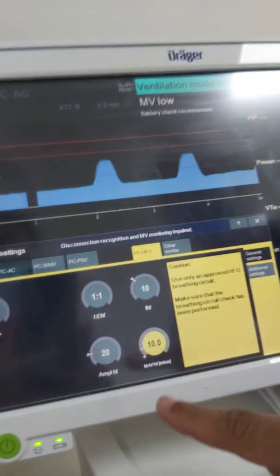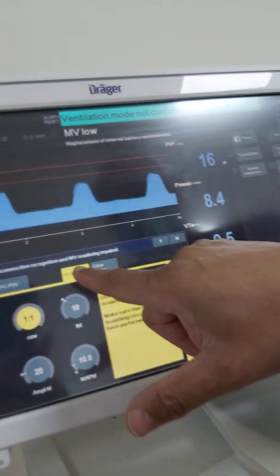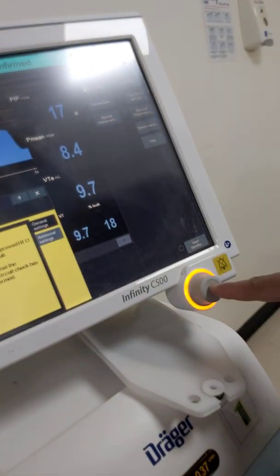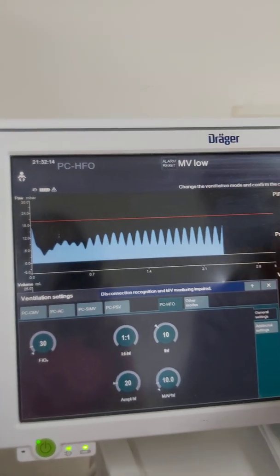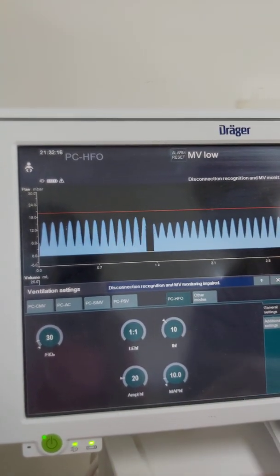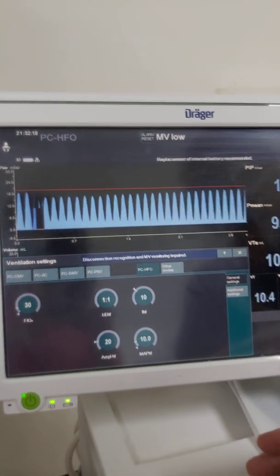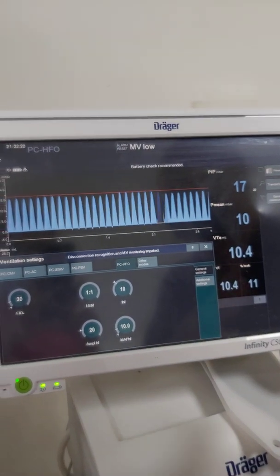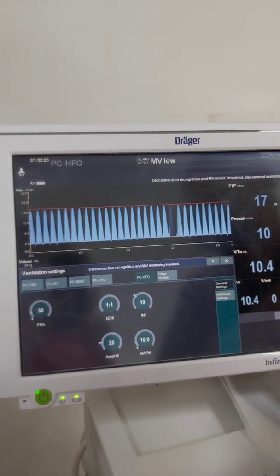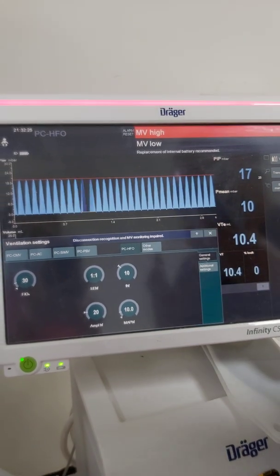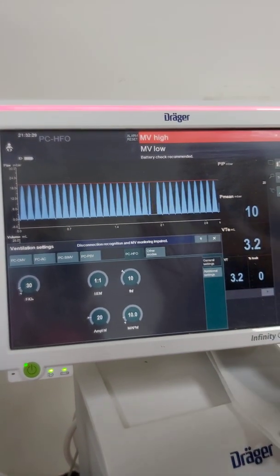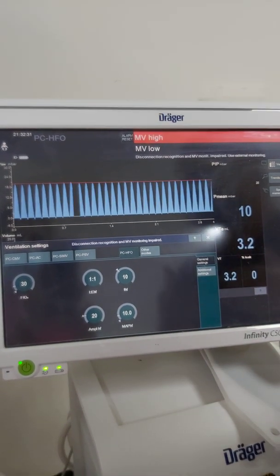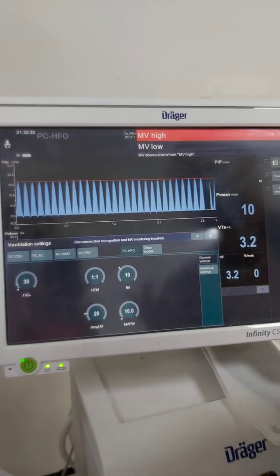I have chosen my parameters and am now shifting the patient to high frequency. High frequency has started with the parameters I chose, based on the approach: optimal lung volume strategy for lung collapse or atelectasis to recruit the lung, or low lung volume strategy for pneumothorax and air leak.